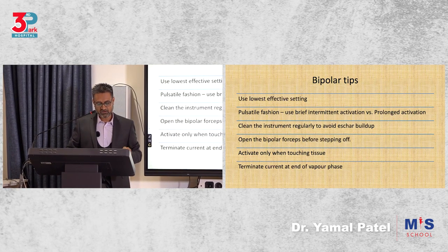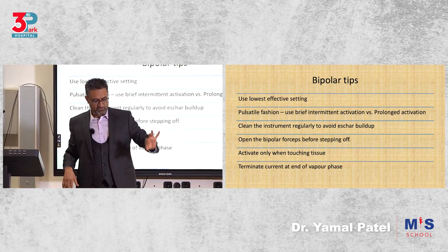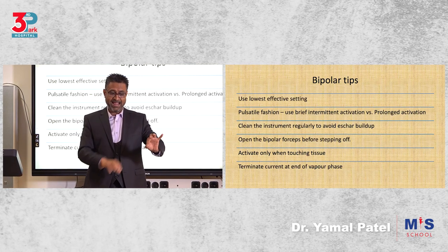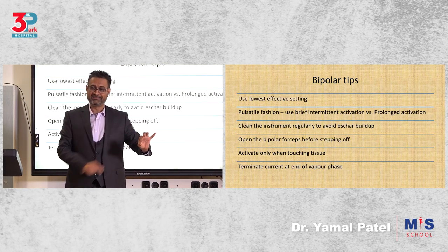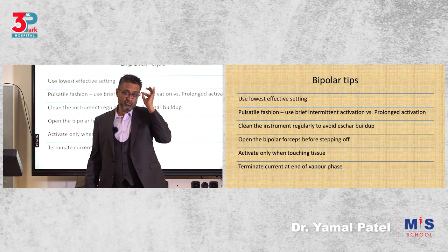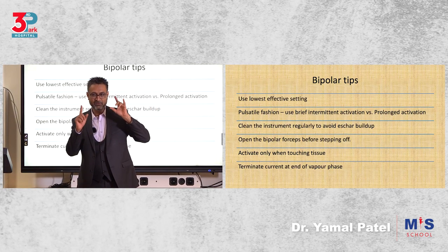Clean the instruments regularly. You open the bipolar before stepping off. Again, another important small point. These small points make a difference. When you've held it, you'll see bubbles forming around because the fluid is bubbling. And then when you stop, this instrument cools down. When it cools down, it will stick to that tissue. Are you getting what I'm saying? So the way to do it: hold, activate, release, release. Did you get my point?